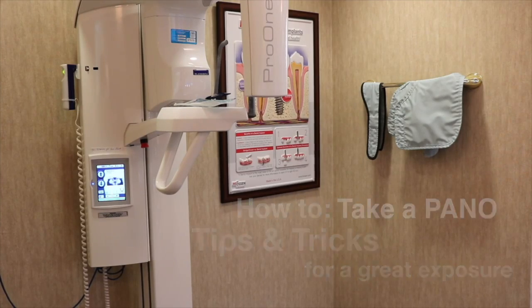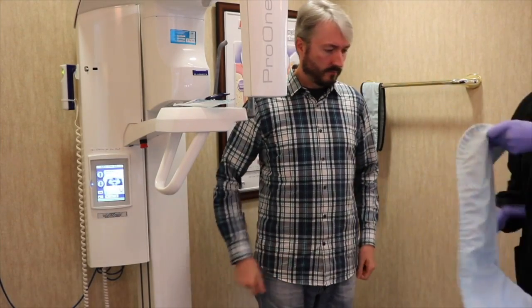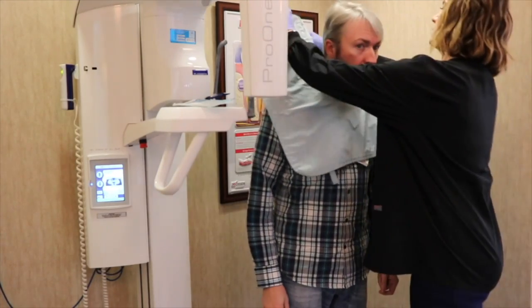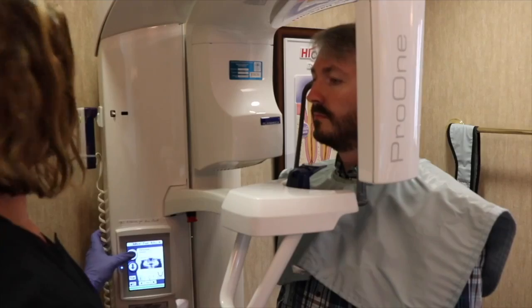Hey guys, quick tutorial today for taking a pano. Start by always asking if your patient has any earrings or tongue piercings, partials, or anything in the mouth. If they do, have them remove the items. Patients should also remove their glasses. Next, cover your patient with a lead vest. Be sure to put it down on the patient's back so it does not get in the way of the radiation and leave a distinctive mark on your x-ray.